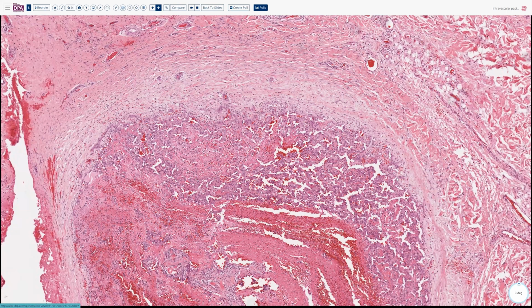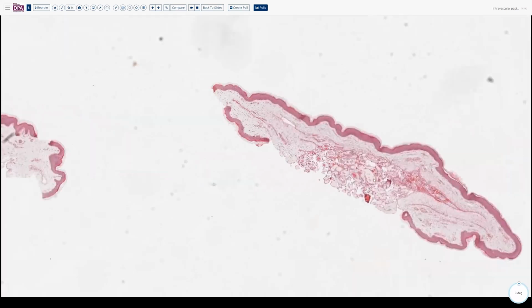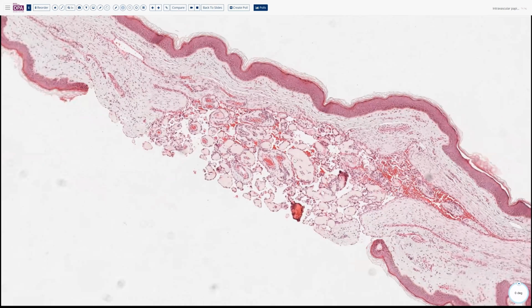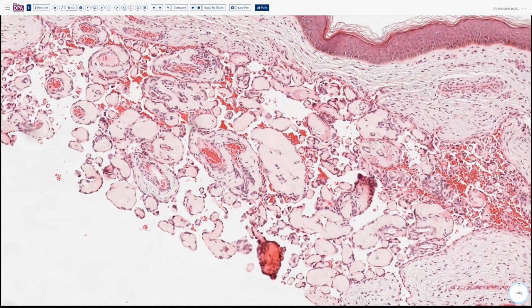Here's another example. As we indicated, these can occur in just about any type of vessel. And here's one with a very thin-walled vessel and very well-developed papillary structures. There's really no residua in this situation of the prior organizing hematoma or thrombus, and just have these very nice micropapillary structures, surface endothelial cells. And note that some of these occasionally have a little bit of a tufted nature or a hobnail appearance to them. So those things can occur in this lesion as well.